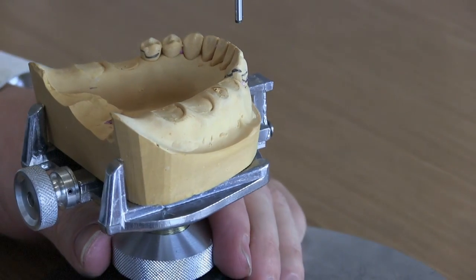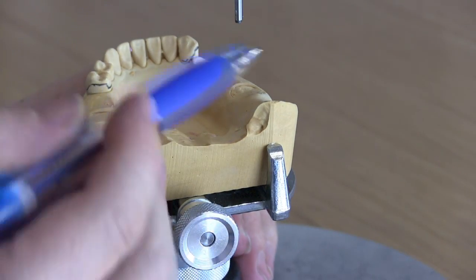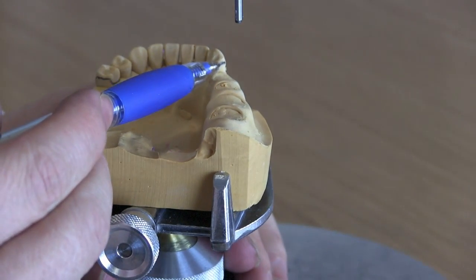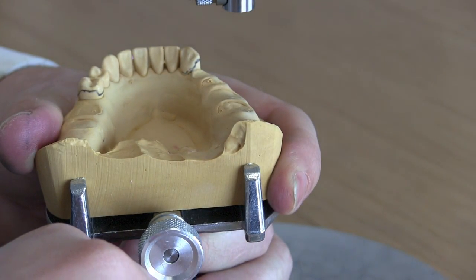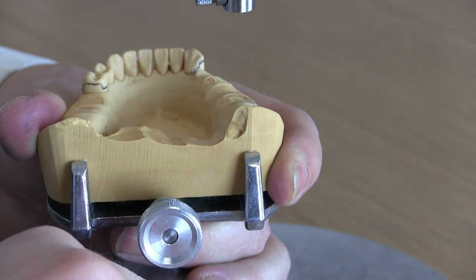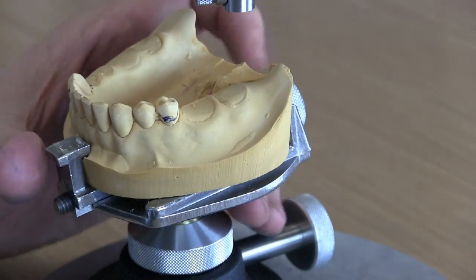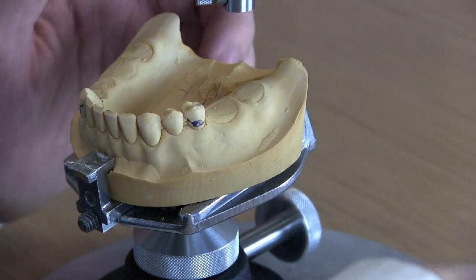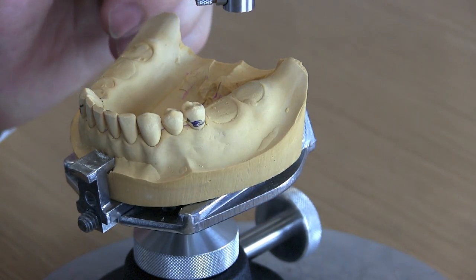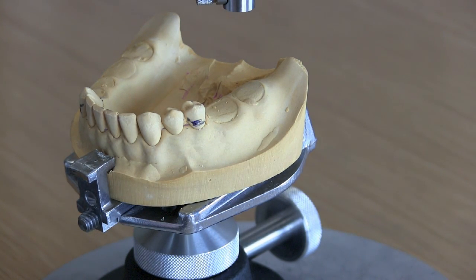There's that undercut — let's tip. I'm going to unscrew this on the back. Look how high this is, and look how high this one is. Now let's tip the table. By tipping it forward relative to that piston that drops down with the analyzing rod, we're now going to change our guide planes to a more tipped-forward position. If I were to put a graphite pencil in and draw that, you would be able to see that we've changed our path of insertion quite substantially.